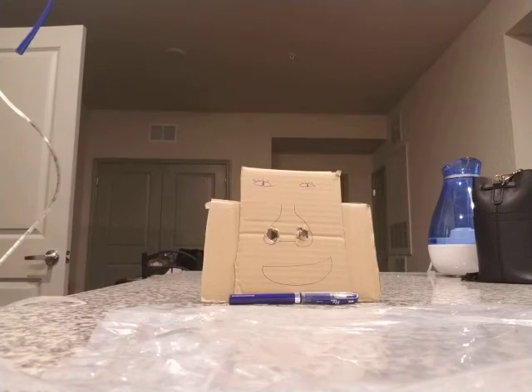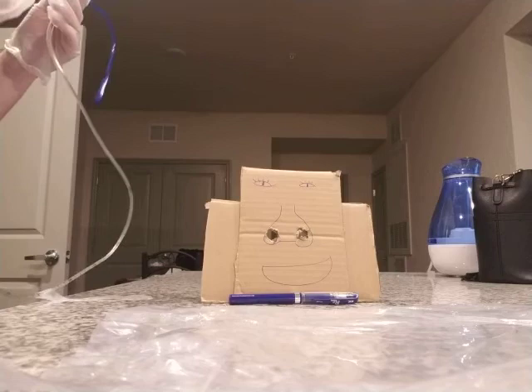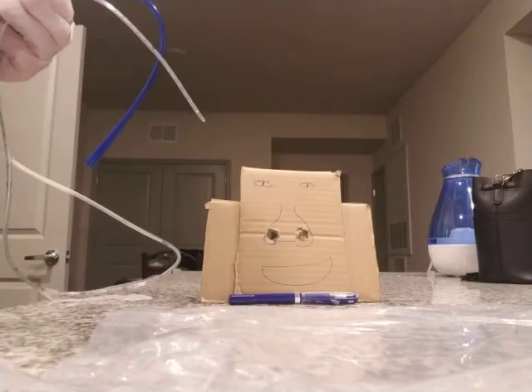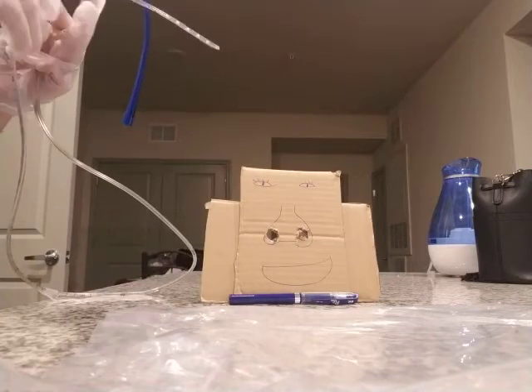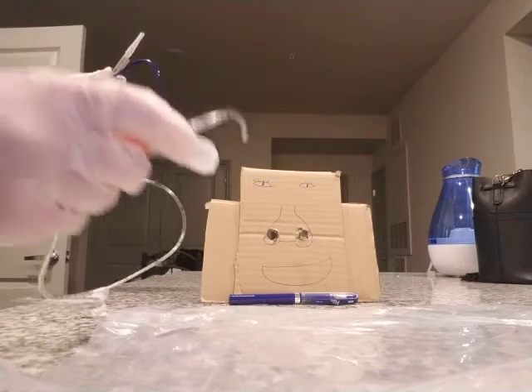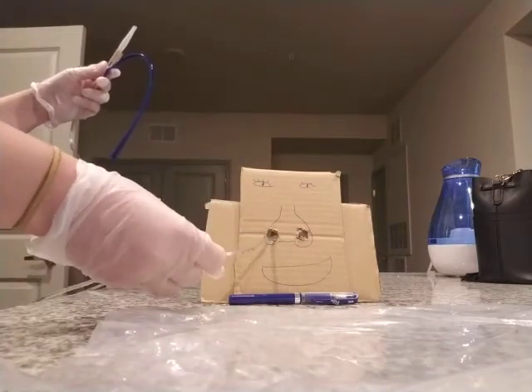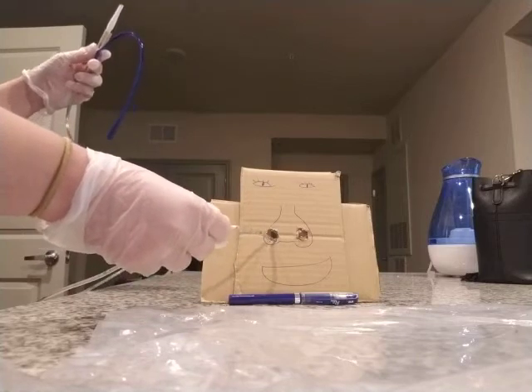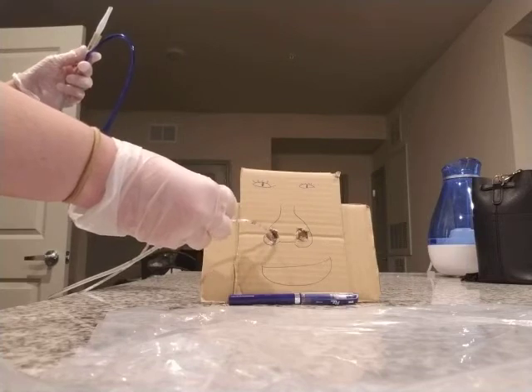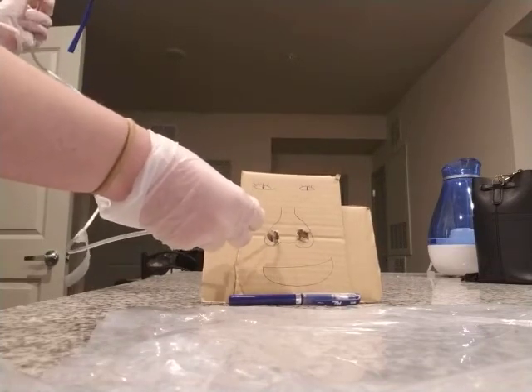I'm now going to tell the client that I'm going to insert and ask them to extend their head back against the pillow. Again, this patient should be in high Fowler's position. I'm going to slowly insert the tube through the nares, curved and pointing downwards towards the ears. If I meet any resistance, I'm going to apply gentle pressure downward and advance the tubing. We're going to insert till we reach our desired spot marked on the tape.